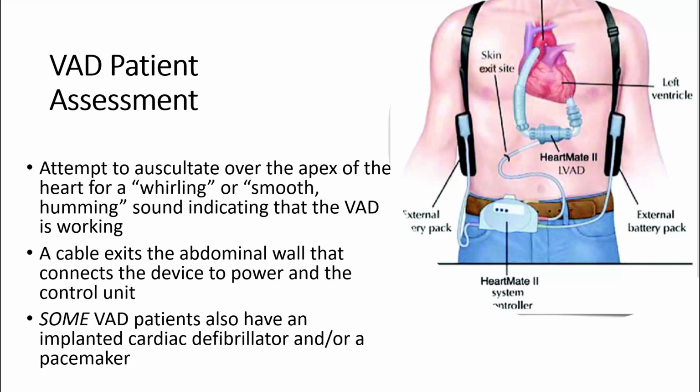Remember, these patients have an intact myocardium. They have a heart there. It's just not healthy. It may need a pacemaker to keep its rhythm, or they may have already had a pacemaker. It may need occasional internal defibrillation. The more the heart pumps, the less work the LVAD has to do on its behalf. So oftentimes they'll have a pacemaker and/or defibrillator to help them.